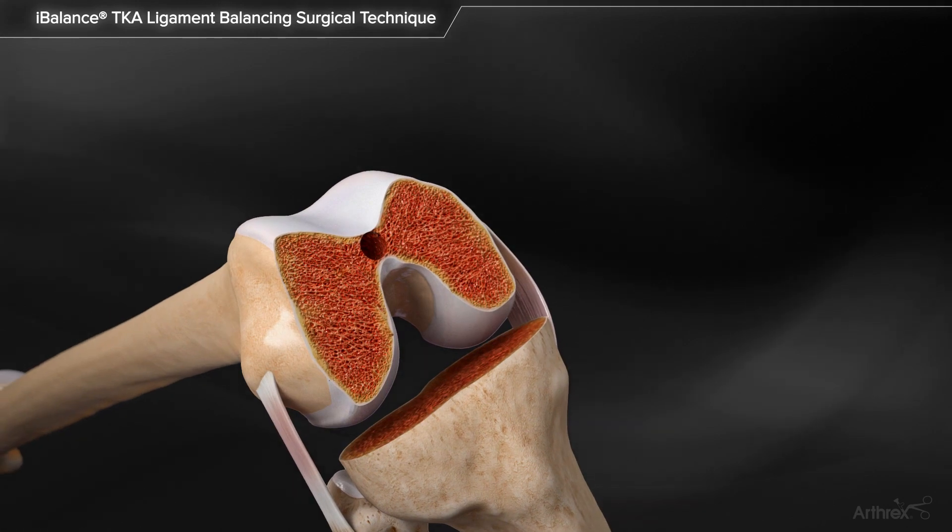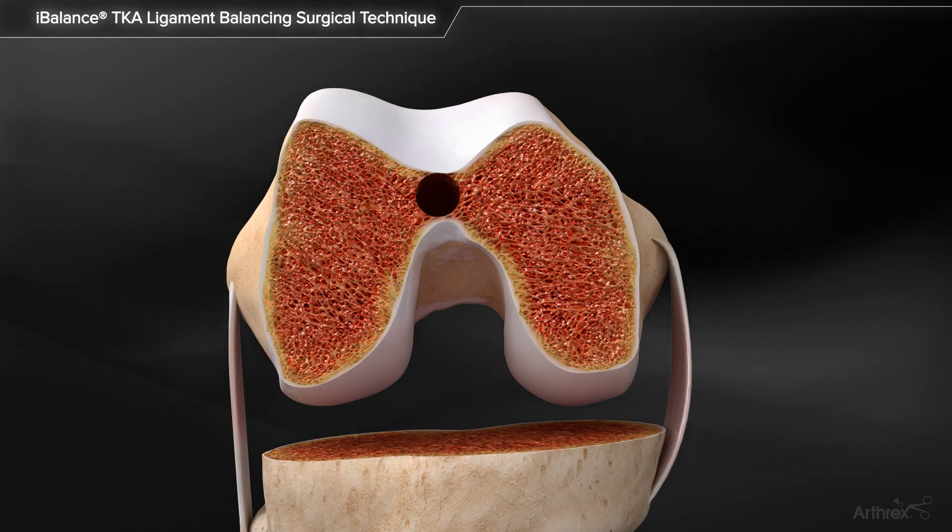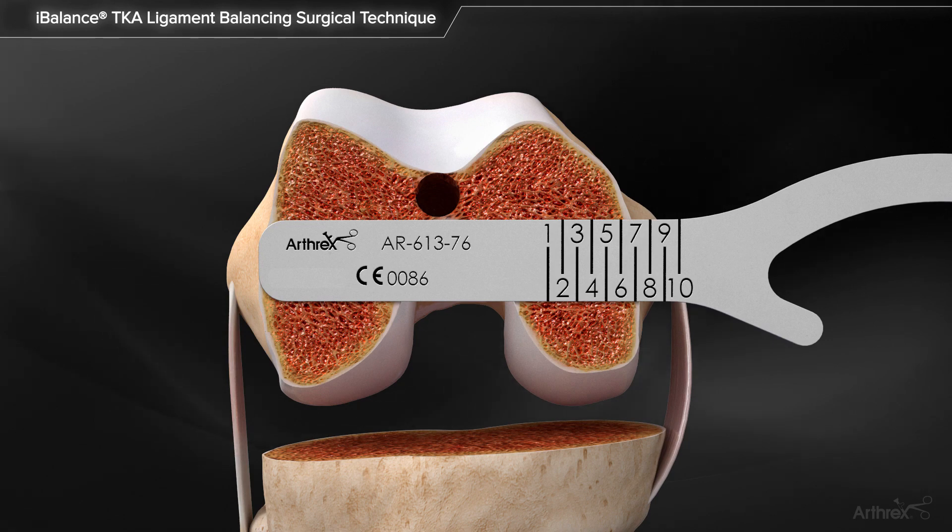The angel wing may be used to estimate the ML size of the femoral component relative to the resected distal femur.